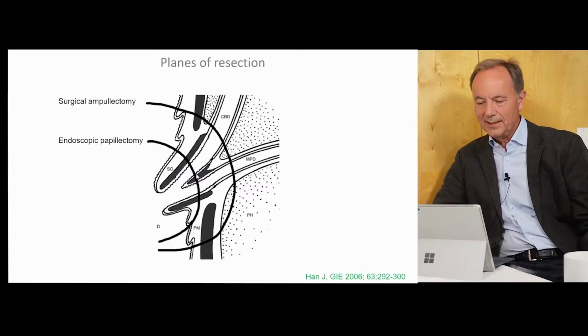What's on your table? Firstly, I think it's important, as with other therapeutic interventions, to start with an appropriate diagnosis, to select patients correctly. And in terms of papillectomy, I'll show this first slide here. As endoscopists, we do a papillectomy, whereas surgeons proceed to ampullectomy, which involves the muscularis propria, needing a reinsertion of the pancreatic duct and of the CBD.